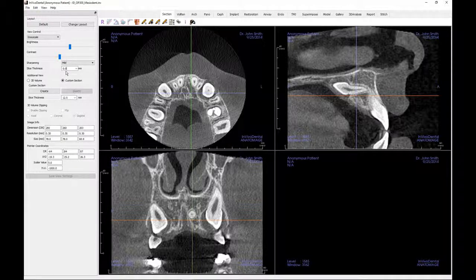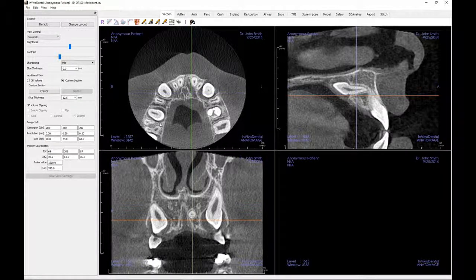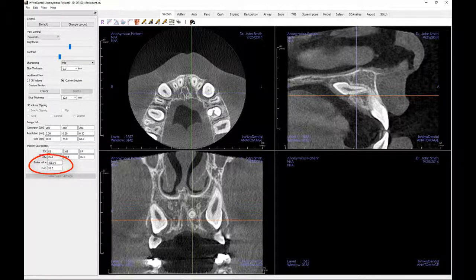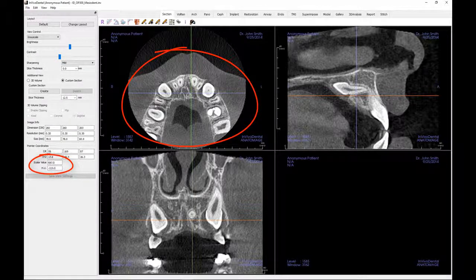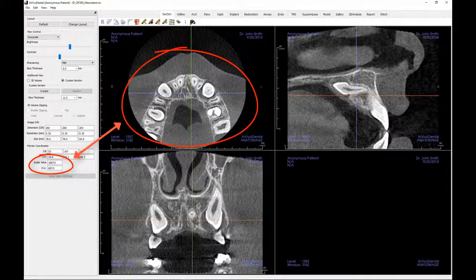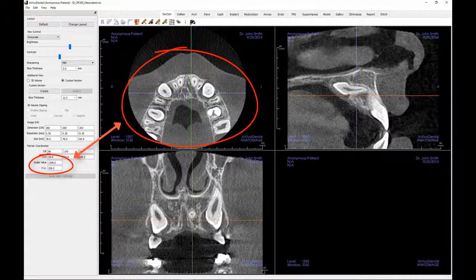Within pointer coordinates, scalar value is the grayscale value of the voxel pointed to by the cursor pointer. Hounsfield units (HU) are an approximate value of the voxel calculated by rescale slope and rescale intercept. This gives us a ballpark idea of the density of the bone — the larger the number, the denser the bone. As you drag the mouse pointer to different areas within the anatomy, the corresponding HU values of a voxel will be indicated.